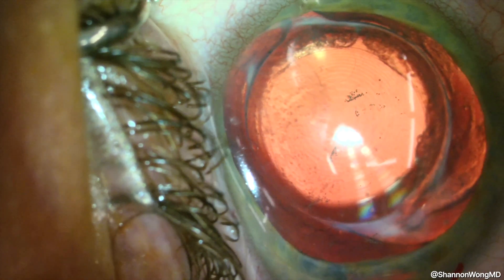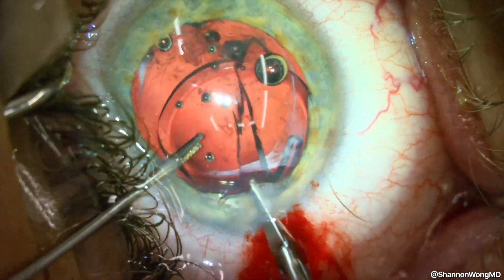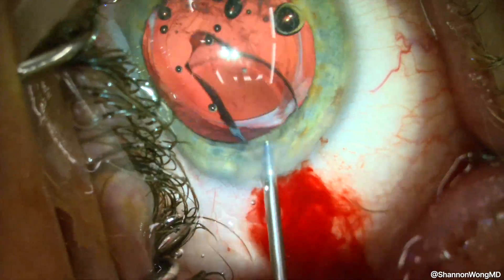This gentleman came to see us from San Antonio. Another surgeon in San Antonio had placed a Symphony lens, and he didn't like his quality of vision with it, so we did an intraocular lens exchange — took out the Symphony and put in a monofocal lens.